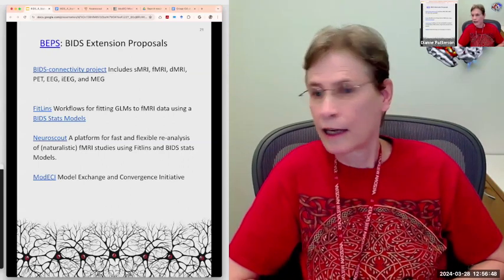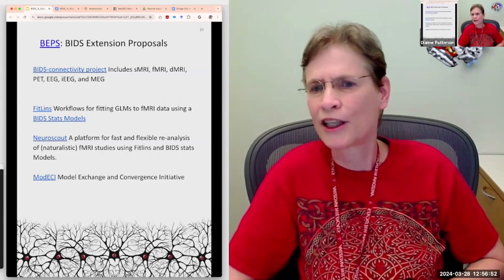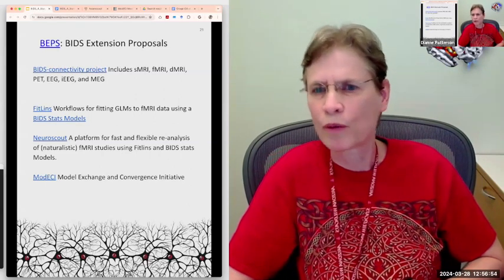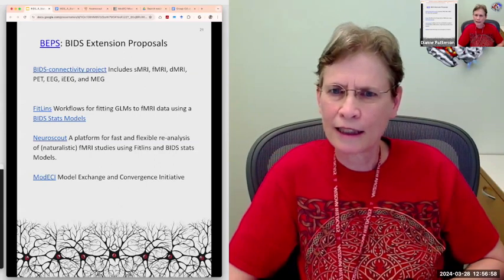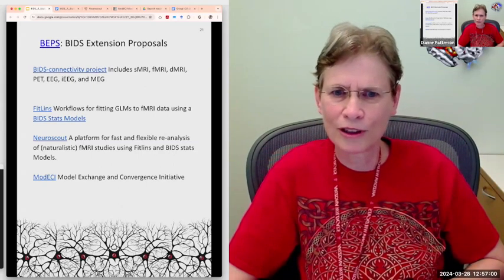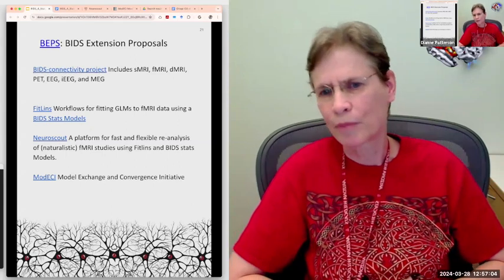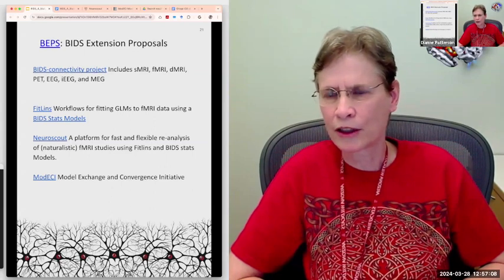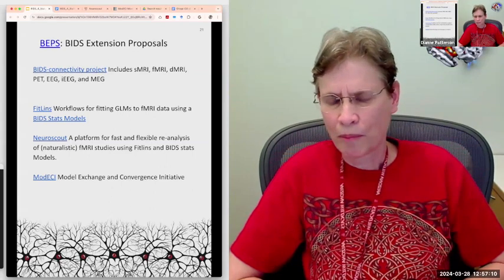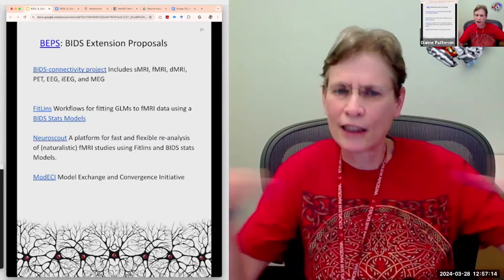It's because of the proprietary underlying format that they've used to create that data set. So it becomes difficult to compare across scanners, for example. The quality metrics are not easily comparable.